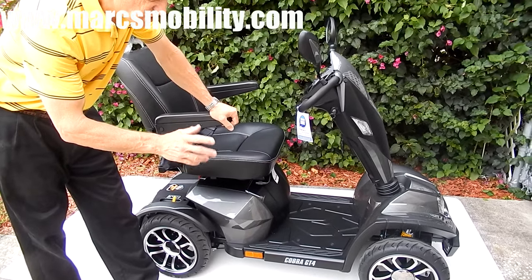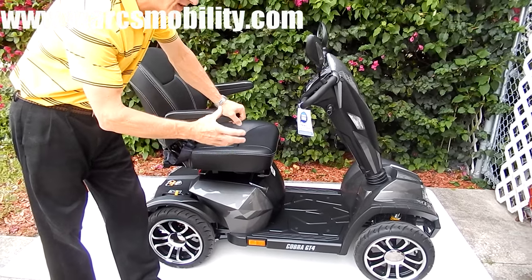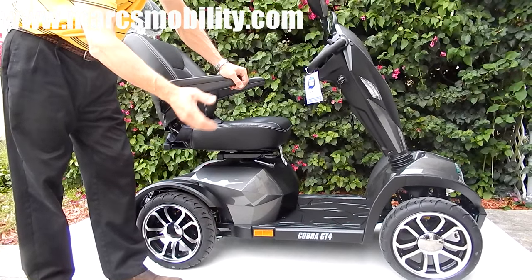This is the Cobra GT four-wheel scooter made by Drive Medical. This is a beast — a fantastic scooter. There are so many things to describe on this scooter, it's unbelievable. First of all, if you want a fast scooter, this is the one.